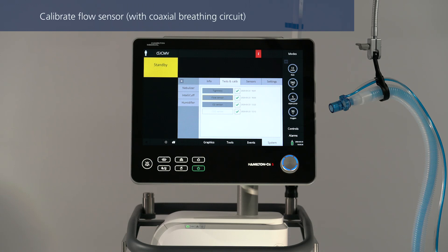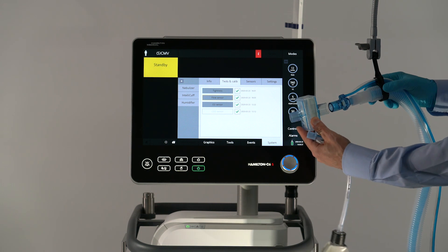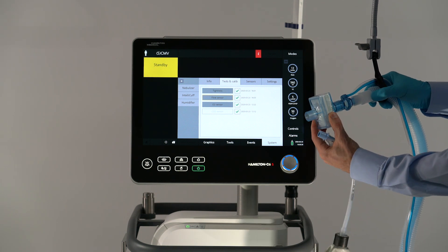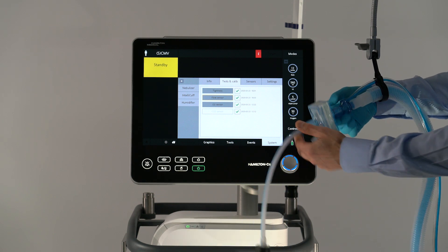If you are using a coaxial breathing circuit, perform the tightness test and flow sensor calibration before connecting an HME filter. Once the tightness test and the flow sensor calibration have been completed, place an HME filter between the patient and the flow sensor.